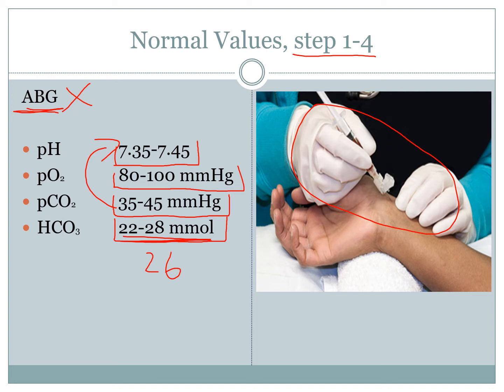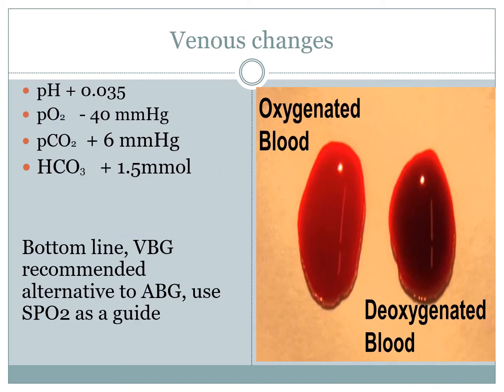So a lot of emergency departments revert to using venous blood in order to do their blood gas. They put a cannula in, take a bit of blood whilst they're running the rest of the tests, and put a little bit off to the side in the iSTAT or the actual blood gas analyzer, and it's done. Nice and quick, part of the routine. Now the differences for things like pH and bicarbonate, and also lactate, just out of pure interest, don't change that much. The changes you'll see between venous and arterial aren't clinically significant.